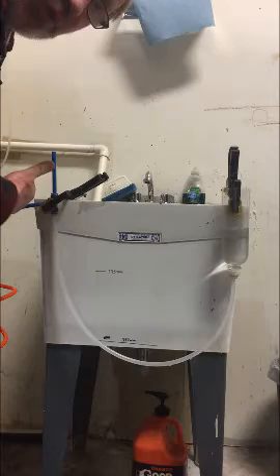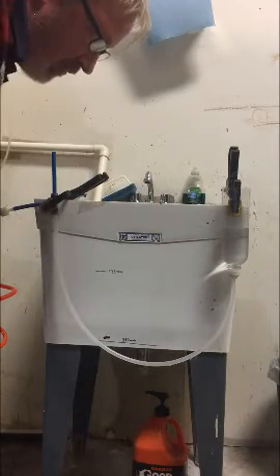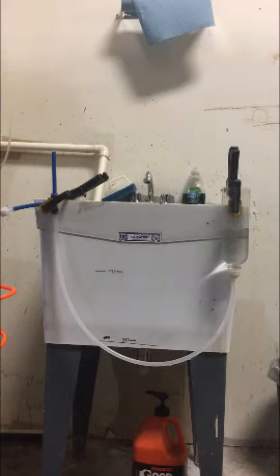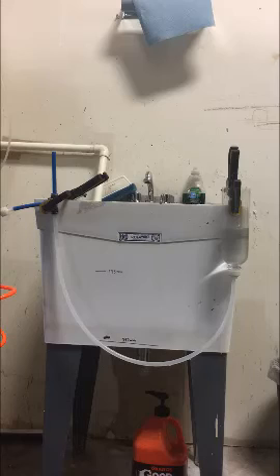I'm getting a substantial pressure surge in my lungs prior to that bottle bubbling over. So it seems to be working as a very effective pressure regulator. Not so much pressure regulator, flow regulator, because it's varying the pressure, and the time is fixed, so the flow is going to be regulated into the patient's lungs as desired with a built-in overpressure valve.